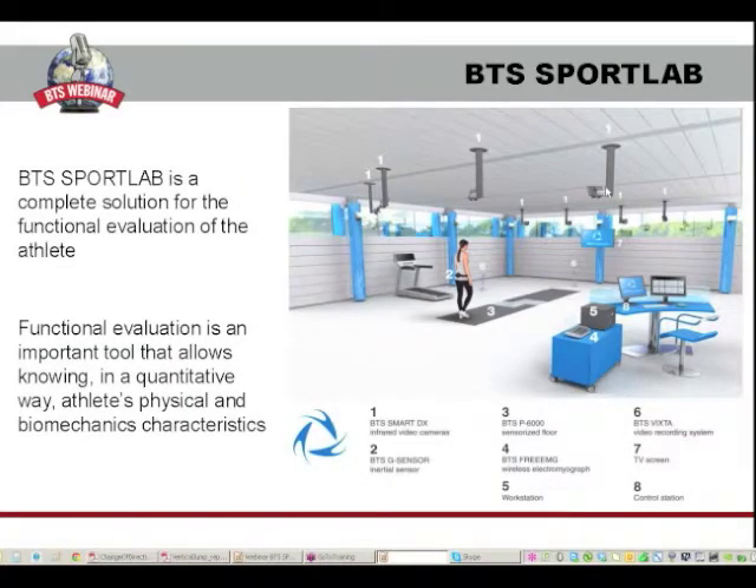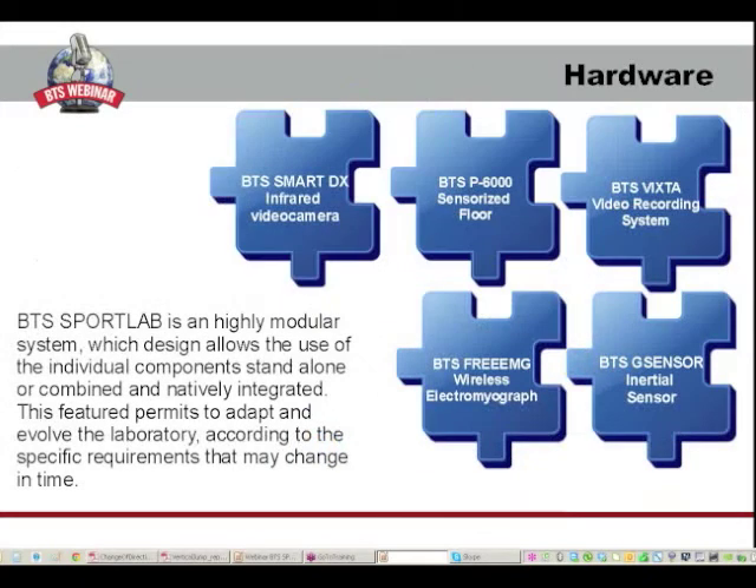First of all, what is BTS SportLab? BTS SportLab is an integrated solution which aims to evaluate athletes. Functional evaluation is in fact an important tool that allows knowing in a quantitative way athletes' physical and biomechanics characteristics. BTS SportLab is a highly modular system which design allows the use of the individual components stand-alone or combined and natively integrated.